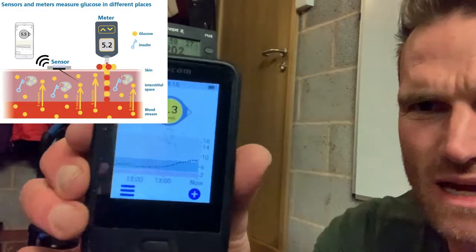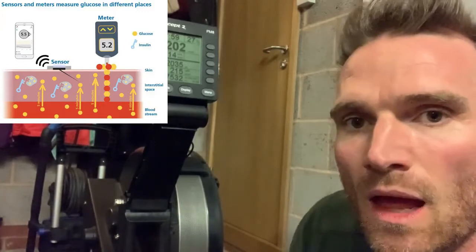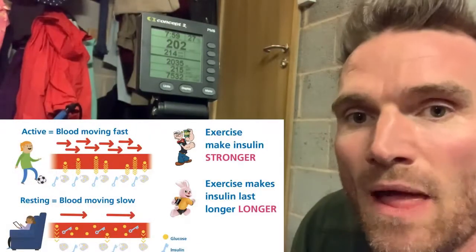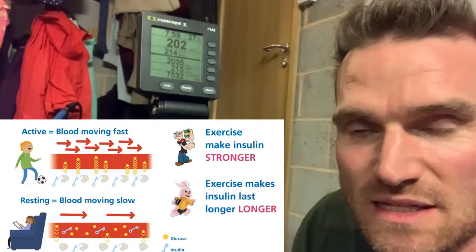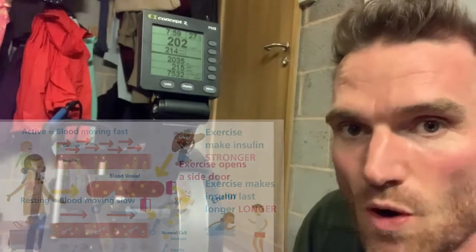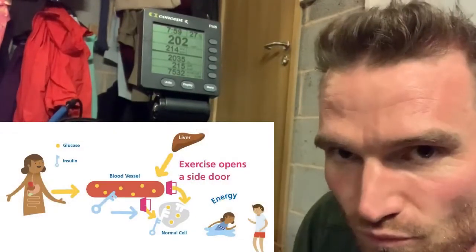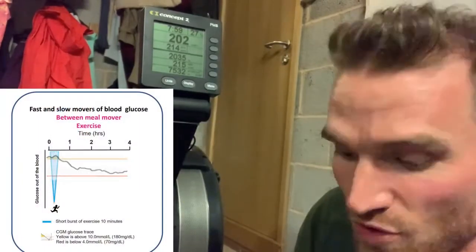At the moment it's now going from 8.4 and rising to 8.3 and steady, so it's already had some effect. But you're not going to see the true effect until about 15 minutes' time when the CGM has caught up with the blood. The exercise has been swishing all my insulin around my body to make it work faster, and also opening the side door to my muscles to allow glucose in — and by the side door, that doesn't require insulin.